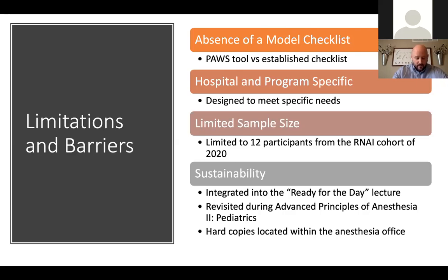And then finally, sustainability. To ensure continued integration of the PAWS tool into the practice of future anesthesia intern cohorts, the tool needs to be easily accessible and readily available. Working with the interdisciplinary team, we decided to introduce the PAWS tool in 3 different locations for future cohorts.